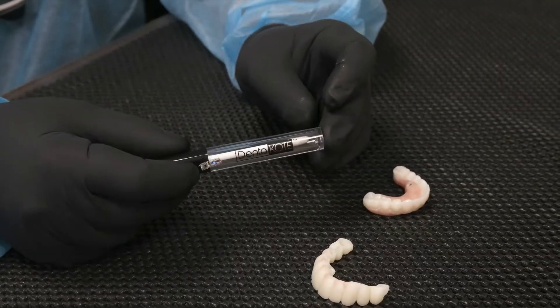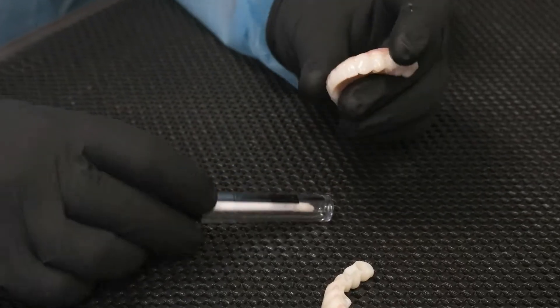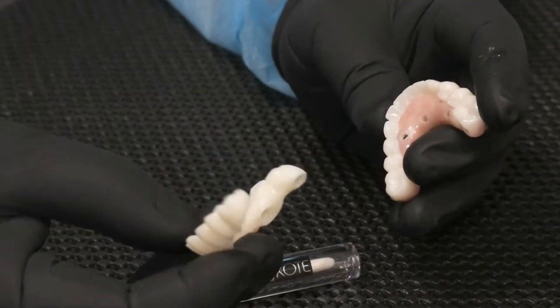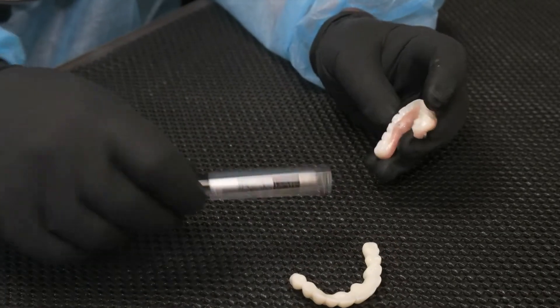Today we're speaking about DentaKote and its application on full-arch implant retained dentures or bridges and full-arch implant cemented bridges. The application is the same.